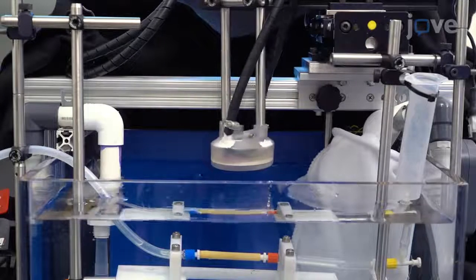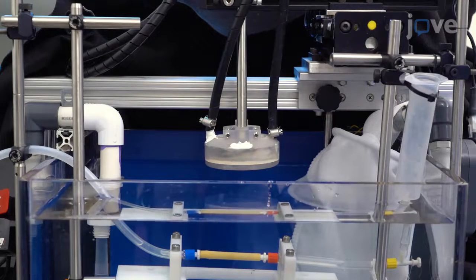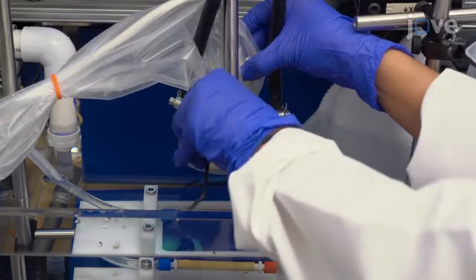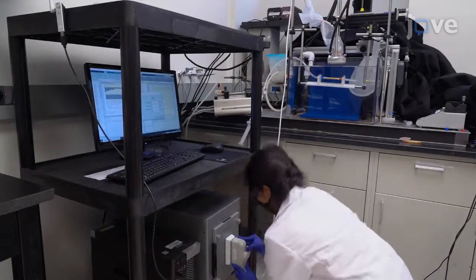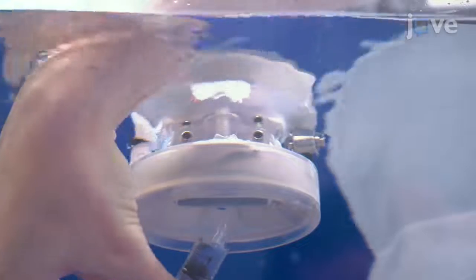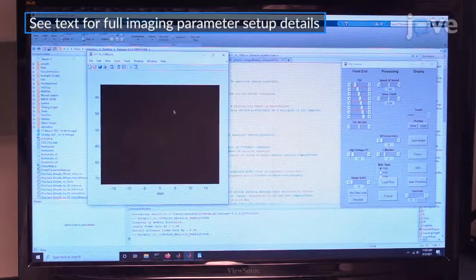To set up the histotripsy source, mount the source onto a motorized positioning system. Cover the imaging array with a probe cover and fix the array coaxially in the aperture of the histotripsy source. Connect the imaging array to an ultrasound scanning system and completely submerge the histotripsy source and imaging array in the tank. Use a syringe to gently remove any air bubbles, and use the imaging array and scanner to acquire degassed B-mode water images at 20 frames per second.